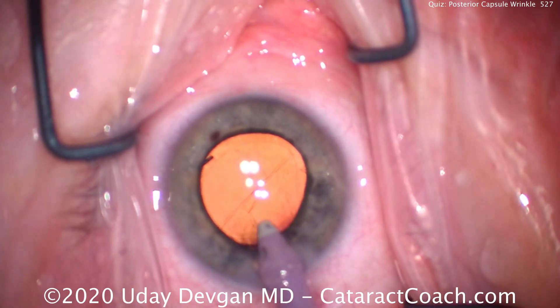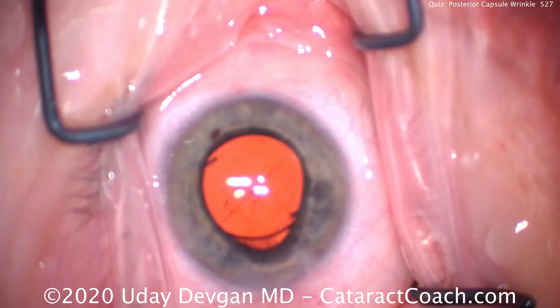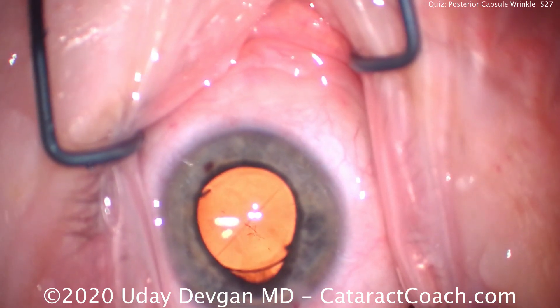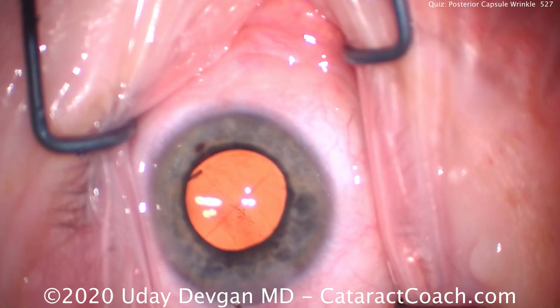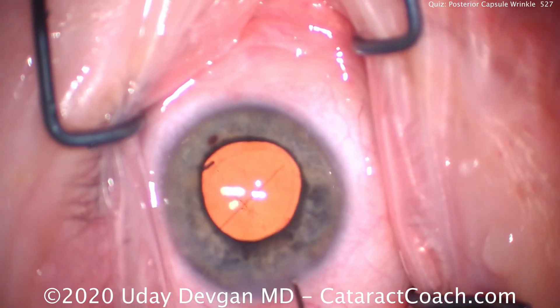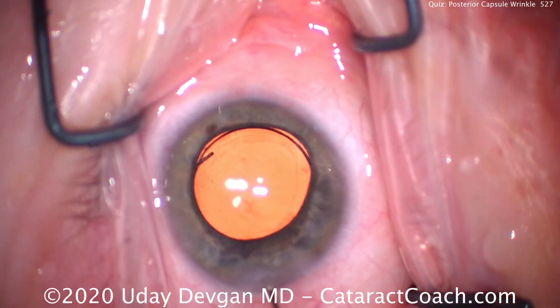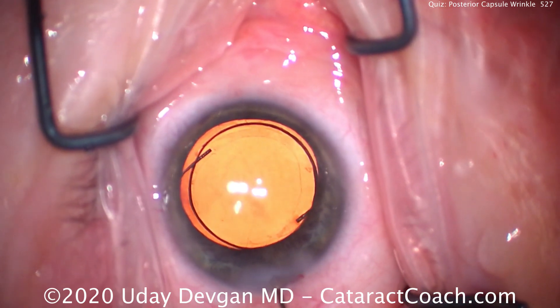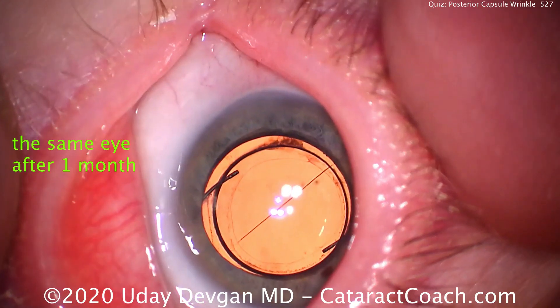It's that diagonal wrinkle right on the posterior capsule. There's the wrinkle again — so come out of the eye carefully, avoiding iris prolapse. There's the wrinkle. We can push the iris back in, let's seal up the incision, and we see a capsular wrinkle there. Now how do we get rid of this? What's the issue? If I hyperinflate the eye like this, the capsular wrinkle seems to disappear, but it won't stay that way.